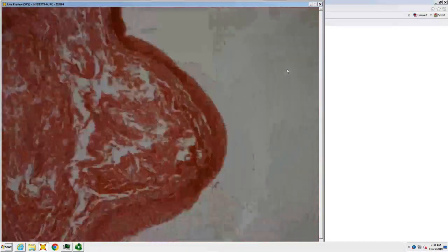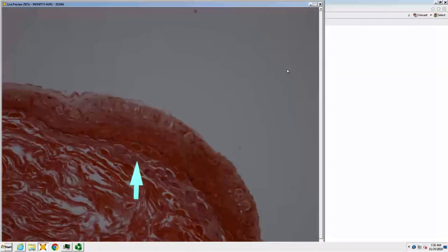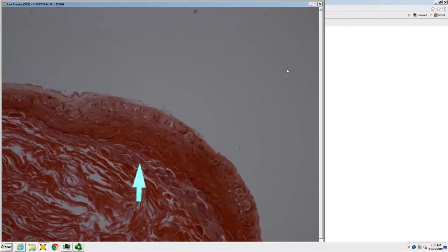This is actually the kind of slide that would perform well, because, do you recognize these structures? Anyone, what are they? Yeah, Henderson-Patterson bodies of molluscum. So you don't have the scalloped, it's not an obvious molluscum, it's a sneaky molluscum, right? So uncommon variants of common things. It's just recognizing the Henderson-Patterson bodies of sneaky molluscum.